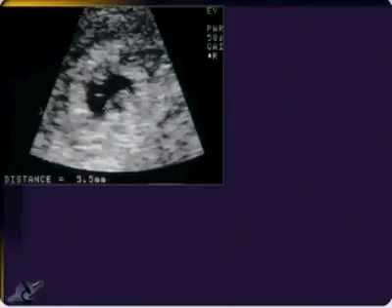All right, woman comes in, and she is pregnant. This is just routine dating, no bleeding, no cramping, no nothing. All right, 5.5 millimeters. Okay, well, I've been nothing if not dogmatic about saying you must be alive by the time you're 5.